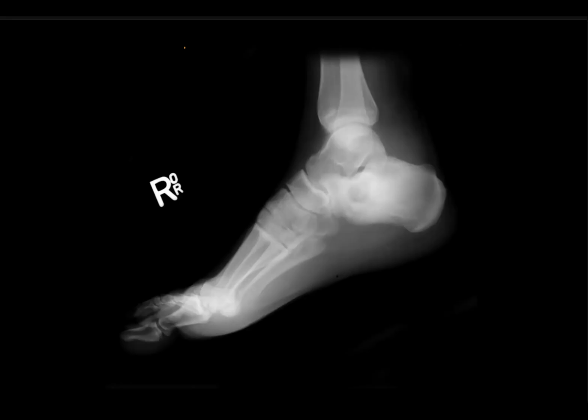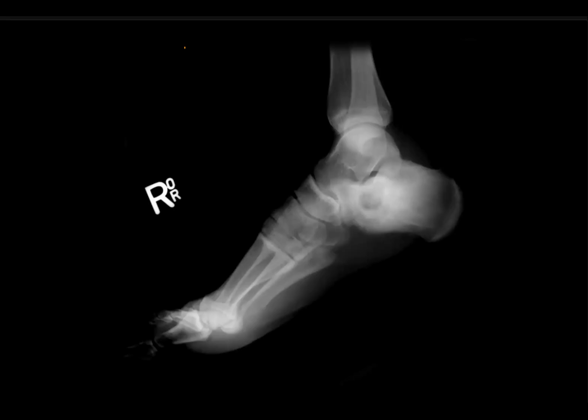I would like to take the history. If there is history of fever, it could be an infectious focus, like Brodie's abscess. Very good differential. What else if the patient is 20 years old?